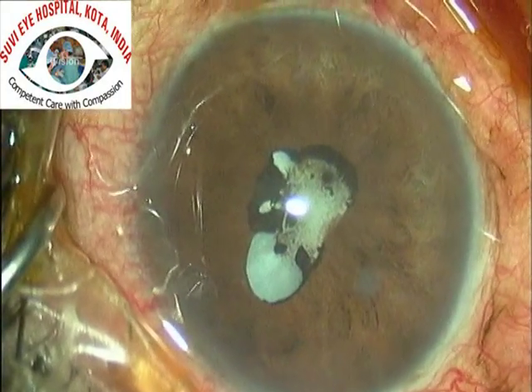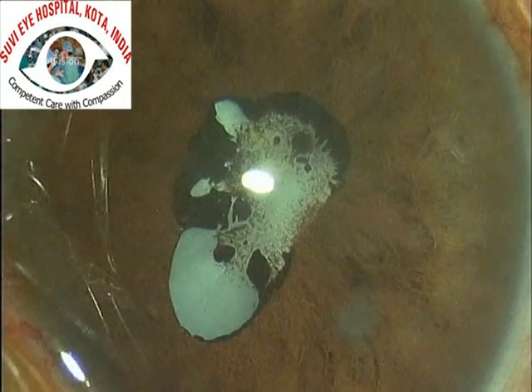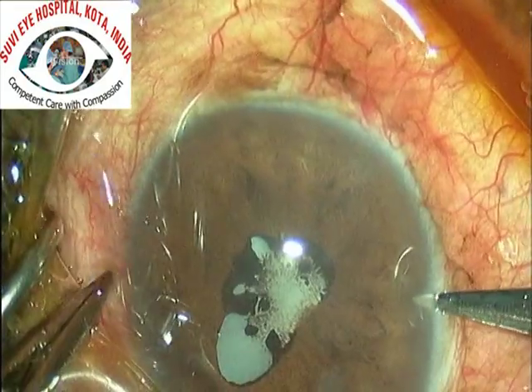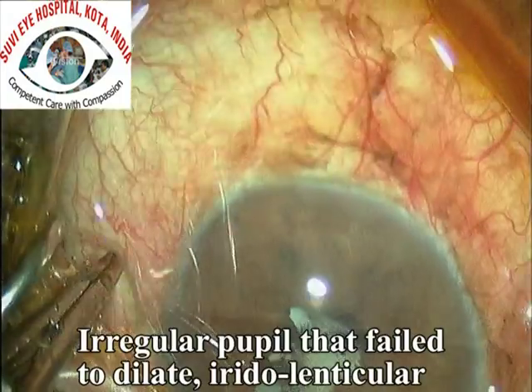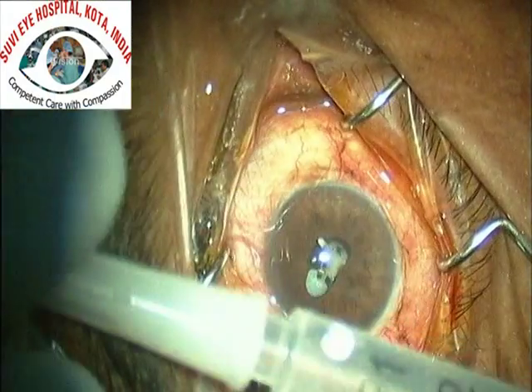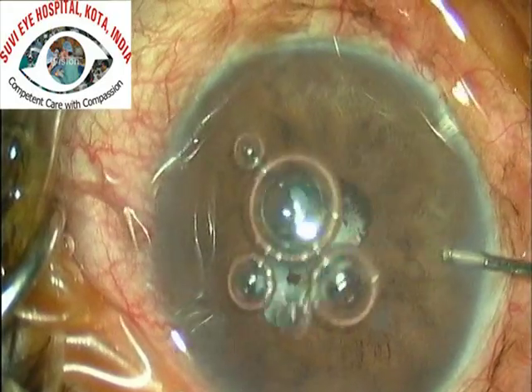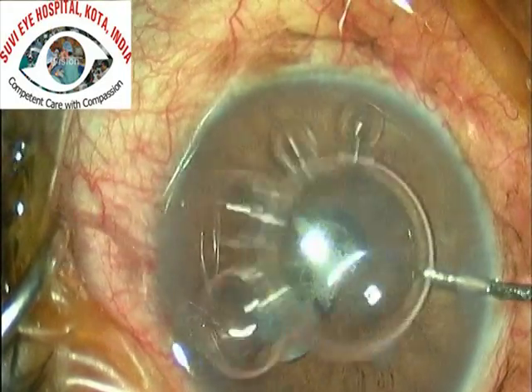This is a case of a traumatic cataract which has a fairly fibrotic membranous cataract with iridolenticular synechiae. The pupil is bound down to the capsule and the cataract is white in color. We have to be well prepared and carefully plan these surgeries, as we may have to deal with a variety of problems. Because the pupil is irregular and had not dilated, we first inject intracameral preservative-free lignocaine into the anterior chamber.